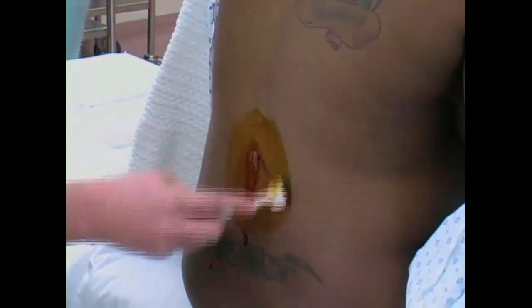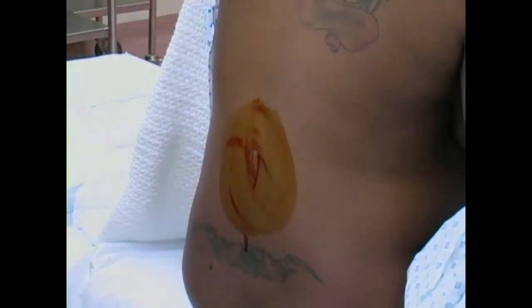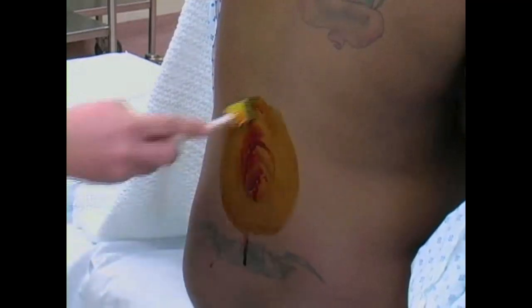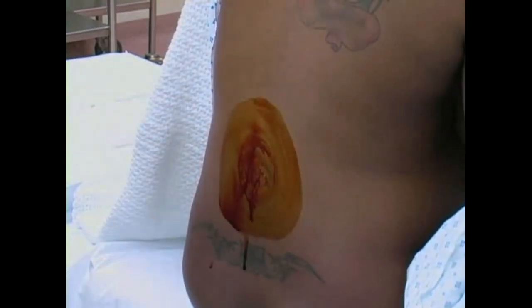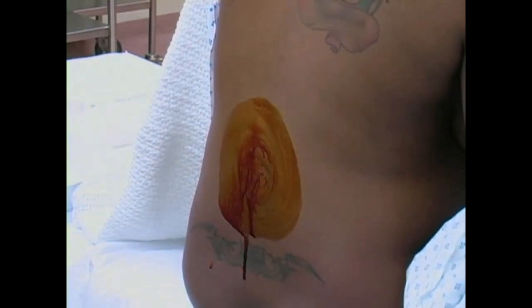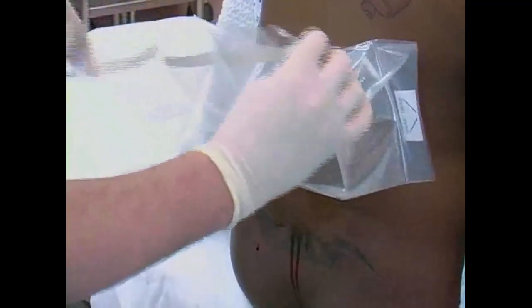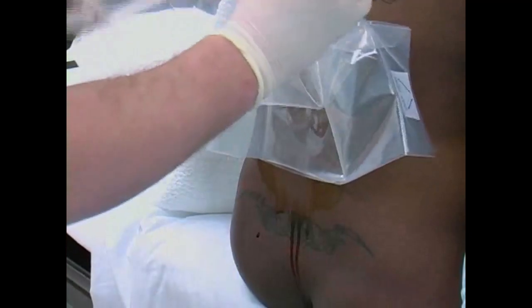Once a lumbar interspace is identified, cleanse the area with betadine solution, wiping in concentric circles. Repeat this process three times. Allow the betadine to dry prior to needle insertion. Place a sterile drape on the back with the pre-cut opening centered on the vertebral interspace that will be used for needle placement.